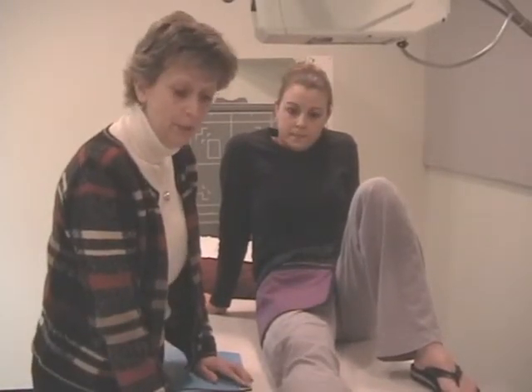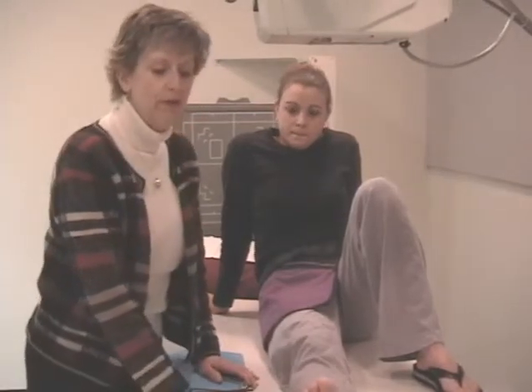The AP positioning criteria, let me review with you. I'll do the oblique first because that's what we shot first. The fibula will be free. The joint space between the talus and the fibula will be opened. Most of the time, the fibula will be slightly superimposed over the tibia. That's a good projection of the AP mortise.